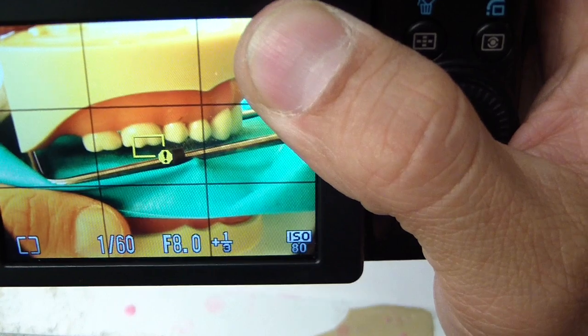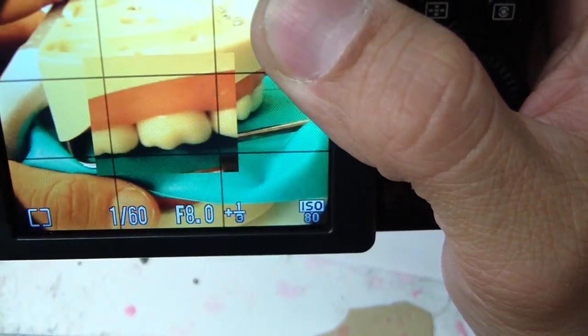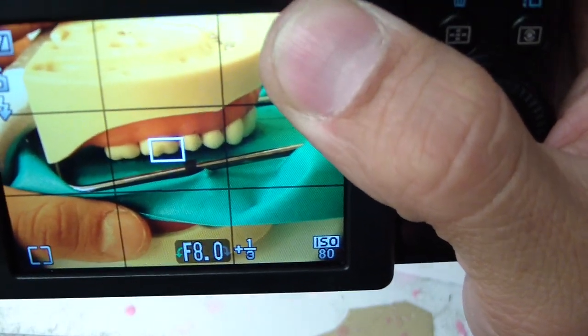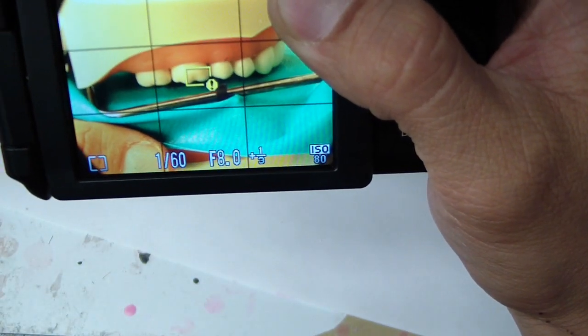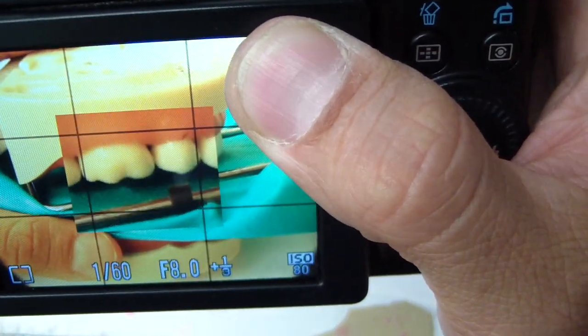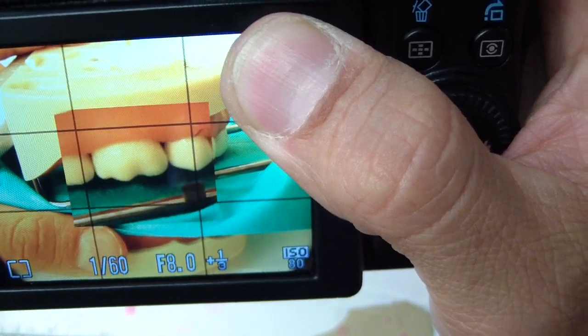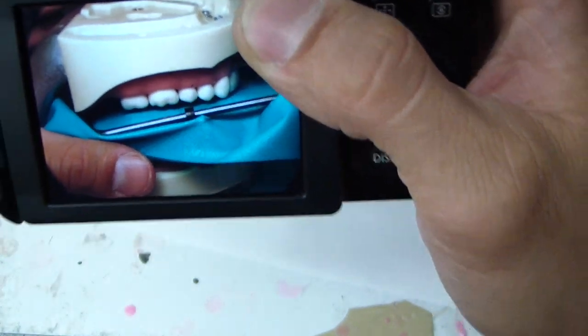And what I'll do, let's see, I'll go into focus. So you see there's that little autofocus. Let me pull back. So I'll go in. You see the little yellow will come up. That means it's not in focus. So I'll have to gauge it and then wait for that to show up, in and out, and take a photo.